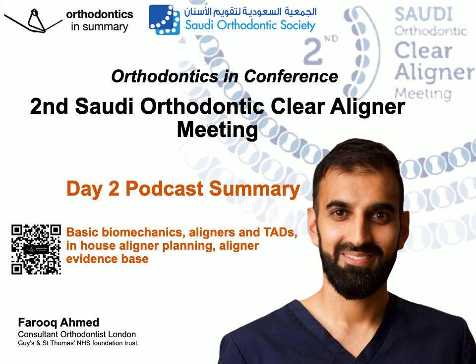So Key's done a study where he observed what changes take place to adjacent teeth when we are active with anterior teeth. And this was again really interesting. Key showed that actually we don't get equal and opposite forces occurring on the adjacent teeth. What we actually get is really unpredictable movements on adjacent teeth. He said that they are biomechanics which are complex, and the occlusal forces add a dimension to aligner use which we still haven't quite grasped.